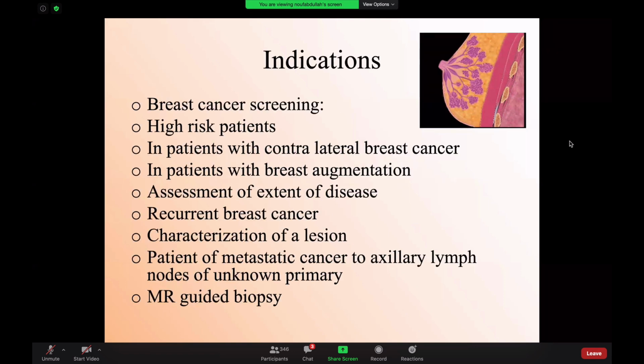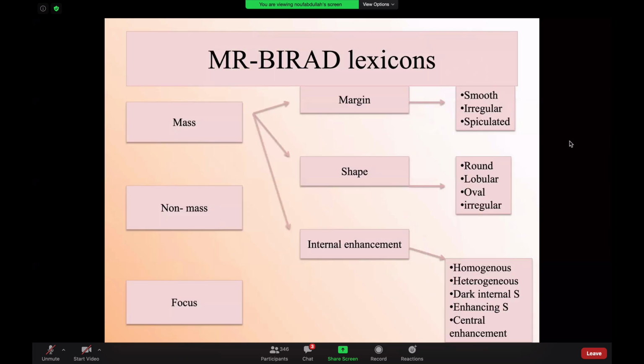Moving into breast MRI. So this is a really big topic, would be difficult to cover, but I will try to give you just a quick idea that you keep in mind. So these are the indications of breast MR. I would advise you guys, if you're preparing for the exam, you memorize 3 or 4 of them. And then you have to know your MR lexicon.